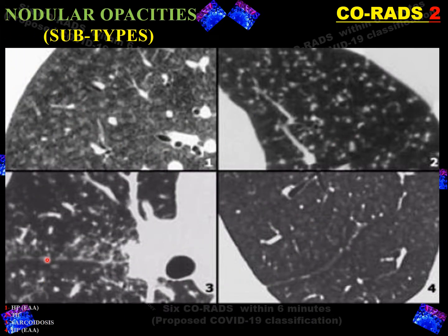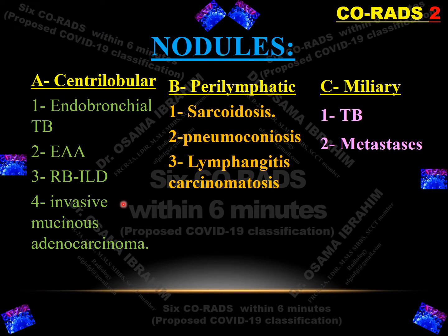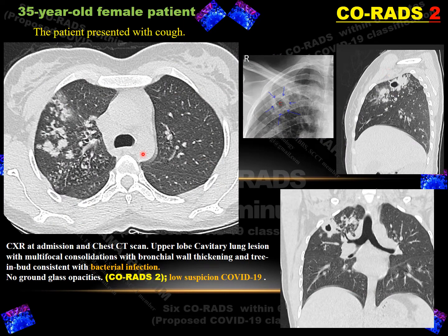If there are nodular opacities like peribronchial or perivascular nodules as in sarcoidosis, or multiple nodules with random distributions, we consider it also CO-RADS 2. These are the differential diagnoses of nodular opacity in the lung. There is another presentation in this channel talking in detail about nodules and how to differentiate them. A 35-year-old female presenting with cough showing multifocal areas of consolidation with a tree-in-bud appearance — this appearance classifies it as CO-RADS 2, low suspicion of COVID-19.